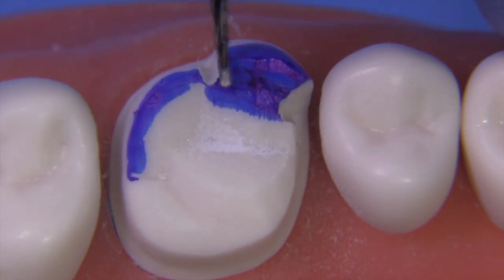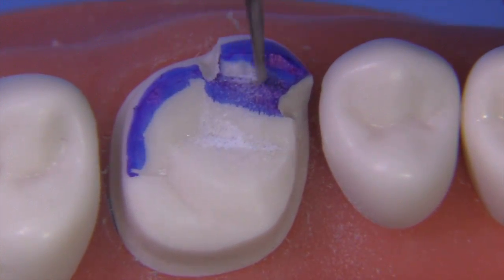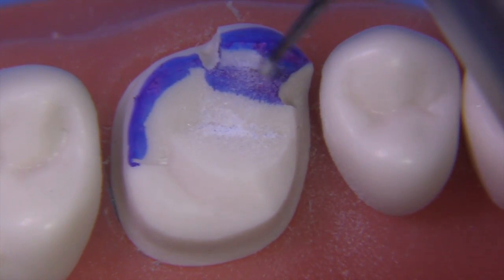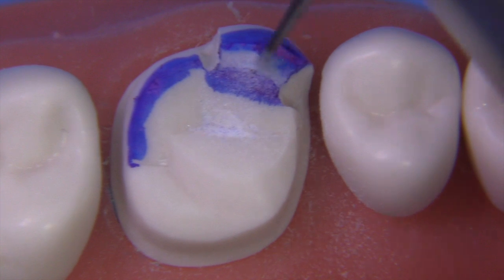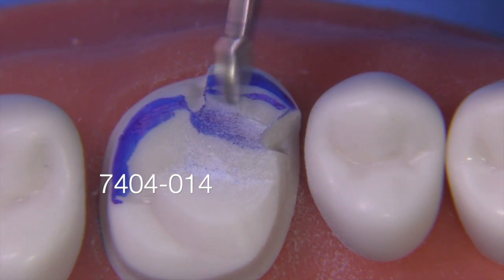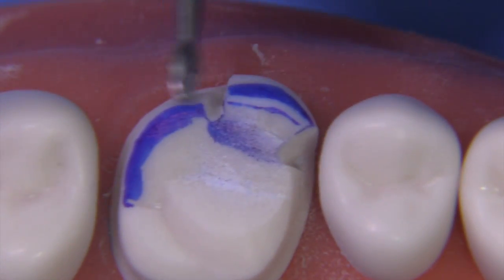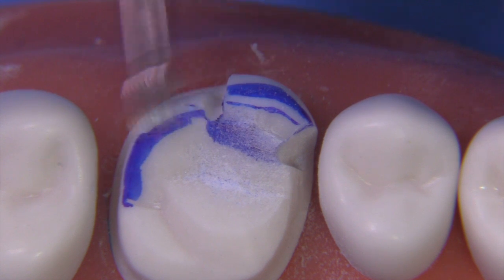Now we'll use a blue dry-erase pen so we can easily see where we're going to make the offset, which will be approximately the same depth as the tip of a 169L burr, following the external outline form of the cusp on the mesial facial. We're then going to use a 7404 to create a 0.3 to 0.5mm contra-bevel, and on the distal facial cusp a little heavier — perhaps 0.5mm.